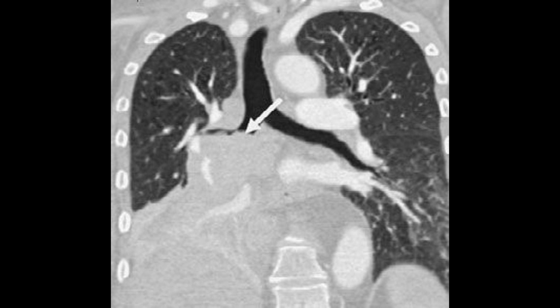A helpful radiologic concept is the double lesion sign, which refers to collapse of two non-contiguous segments or lobes, implying more than one obstructing lesion. In this case, however, both affected lobes are adjacent and share a common bronchial supply, so a single central lesion is the likely cause. In terms of management, when lobar collapse is due to mucus plugging, pulmonary toilet and bronchoscopy to remove the obstruction are appropriate.